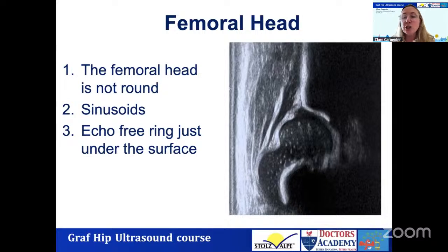Within the femoral head, you see white flecks. Those white flecks are the immature sinusoids, or the blood lakes within the hyaline cartilage of the femoral head. And as we know, as the femoral head matures and you get a primary ossific nucleus form, the more mature vascular supply starts to form. So those little white things are good, normal, healthy blood supply to the immature femoral head.